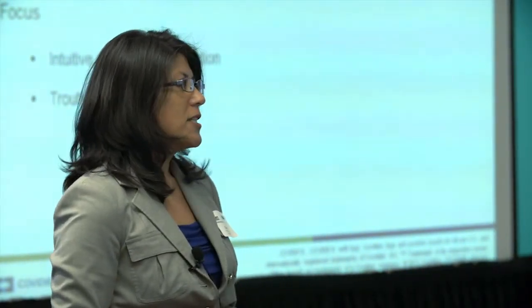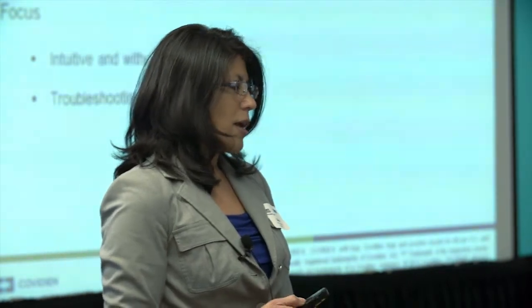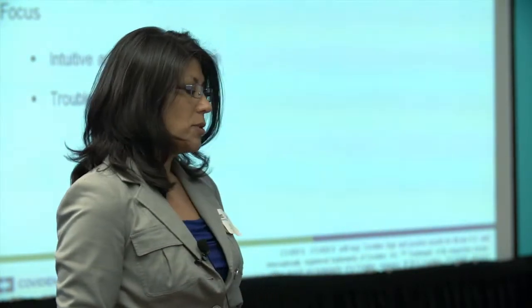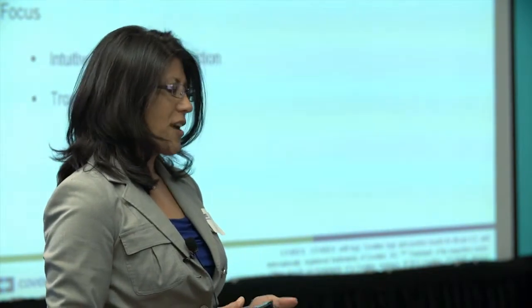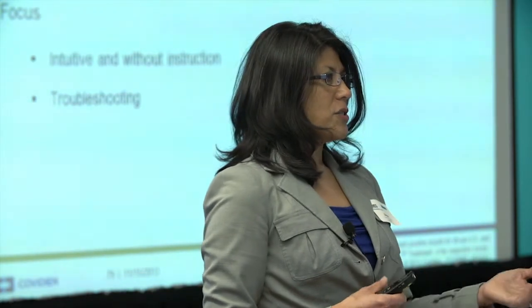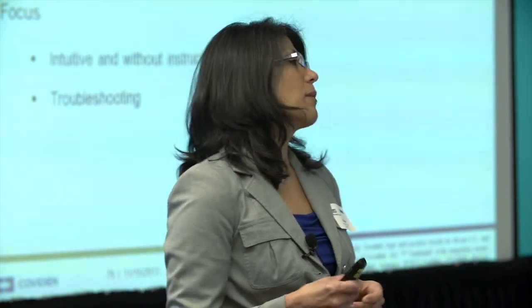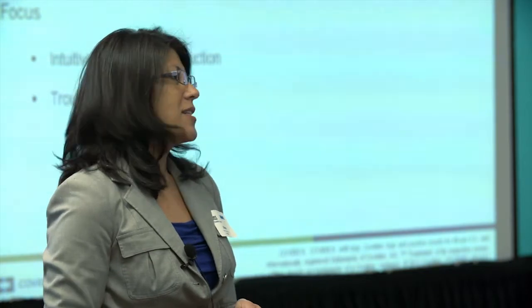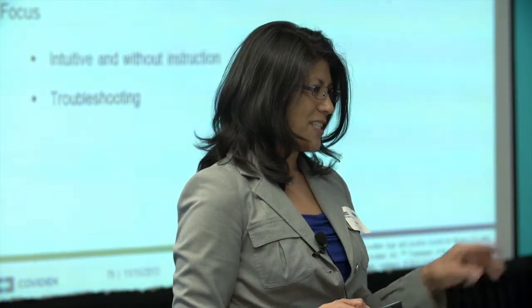We looked at difficulties and physical challenges, or the potential for them to possibly drop the equipment while they were handling it. And then with respect to the troubleshooting, we discovered what the user would instinctively try if we induced a fault for them, and then how much were they really willing to troubleshoot. And we found out that they're willing to try 3 things, and that was about it. So we had to make sure the device was working after about 3 attempts.